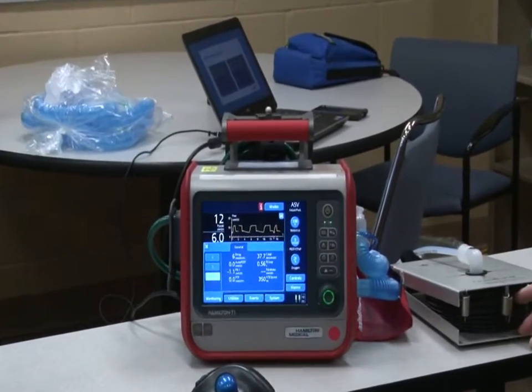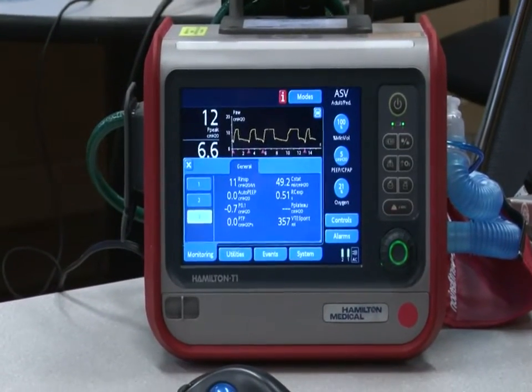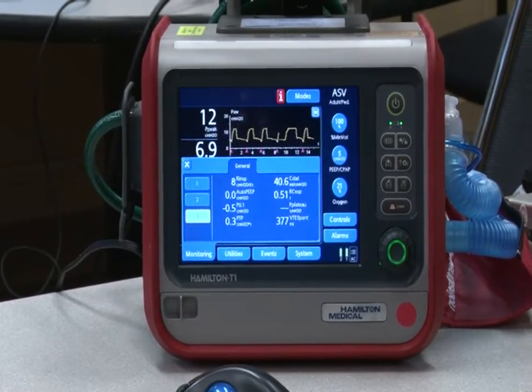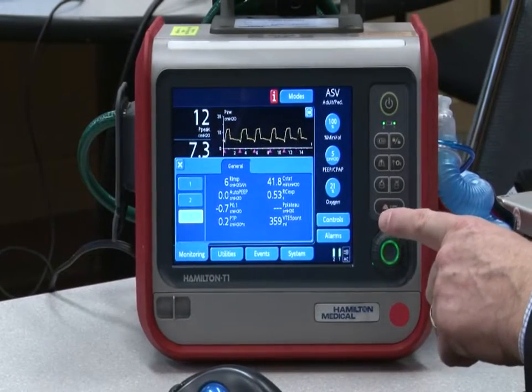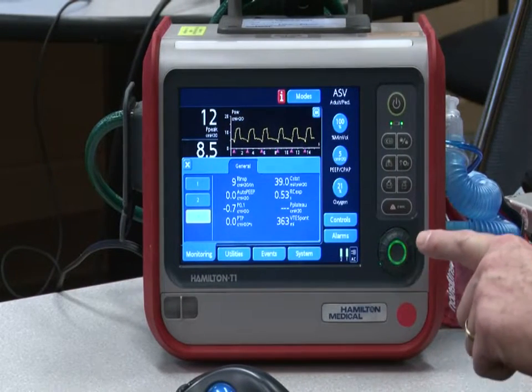So that's minus 1.1. So that patient has minimal work of breathing. 0 to -3 is normal. -3 to say -5 is moderate, and above that is excessive. So this patient's breathing spontaneously, but the rate's okay. They don't look like they're in distress. The rest of the vitals look okay.